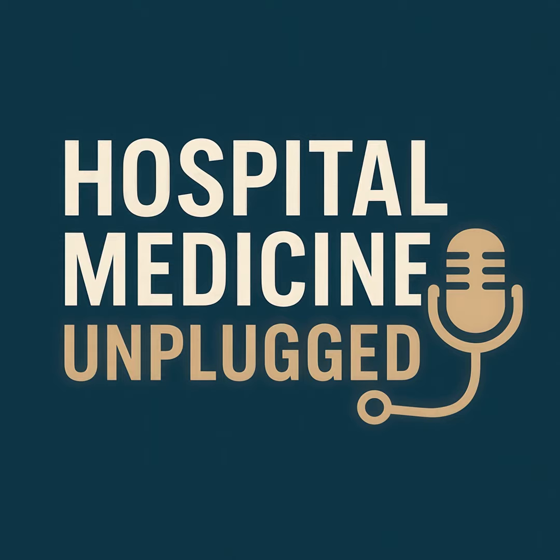That initial phase is all about vigilance. Nursing and RT staff need to be checking vital signs, heart rate, BP, respiratory rate, SpO2 very frequently at first, maybe every 15 minutes for the first hour, then relaxing slightly to every 30 to 60 minutes while the patient is still unstable. But it's more than just vitals. They need to be assessing the mask leak.